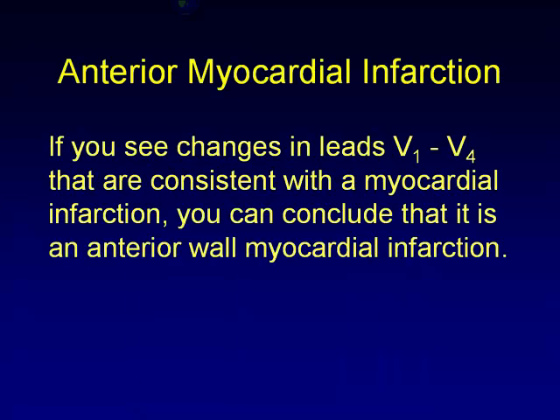To look at the anterior myocardium function, it is very good to look from V1 to V4 in general. I think this is more accurate because you cannot say exactly where the infarct is, because as you know, the people who do the ECG sometimes are not very good at putting the electrodes in the correct place.